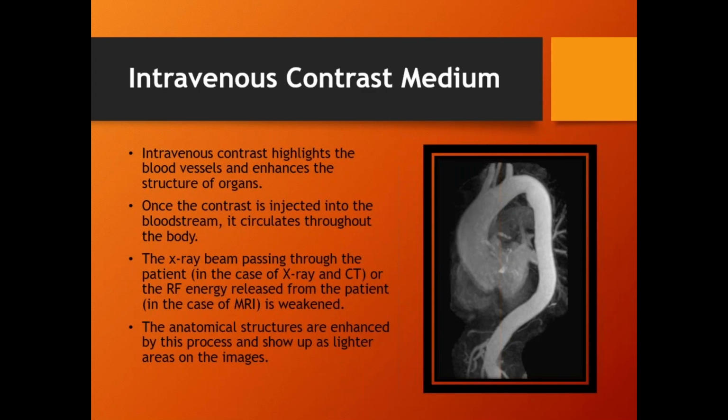As you can see, this right here is an image of the heart. You can see the heart in the background, but this large, very bright vessel coming out here, that's the aorta. And you can see how incredibly effective it is. I mean, this image was obviously taken with the aorta completely filled with contrast, and you can barely make out the heart in the background because it's a bit darker.